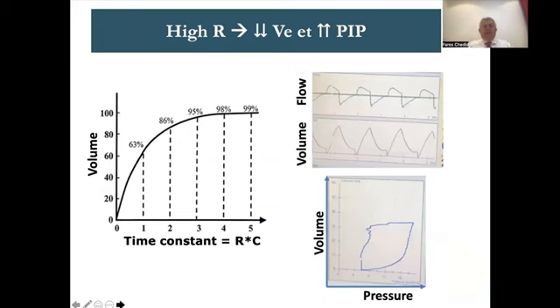Let's progress. I always ask that question, and I often get a wrong answer, but I know you're bright and you will probably answer correctly. What would you do if you see that your I time is short, as I showed in the previous graph? You see here, this is the flow graph. Normally, it should start from 0 and return to 0. The flow graph here didn't return to 0 because the inspiratory time was cut off.